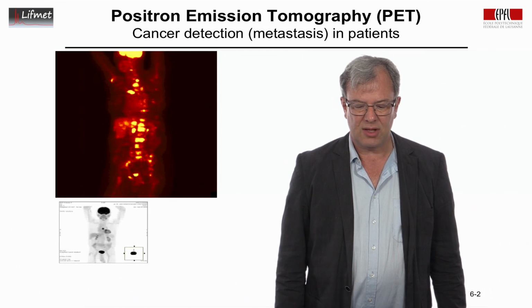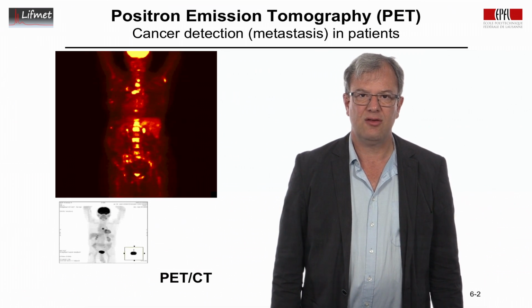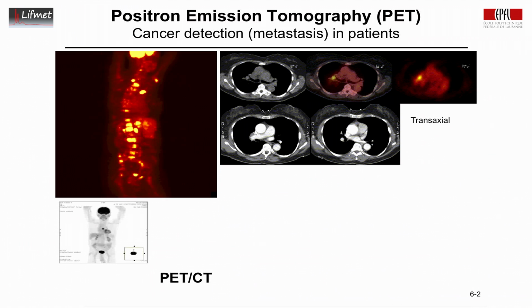The application actually is PET-CT nowadays. You can actually nowadays no longer buy just a pure PET scanner. You buy a PET-CT scanner. And the reason is illustrated here in this example.